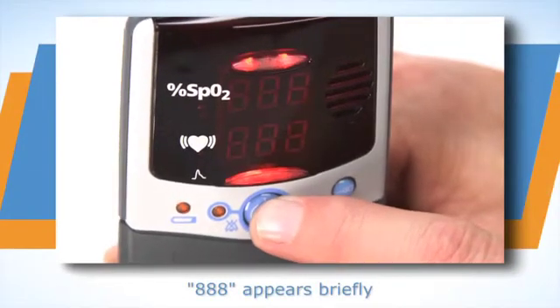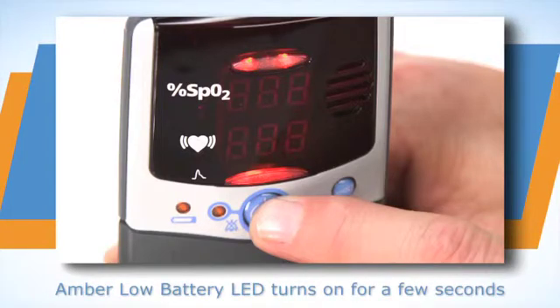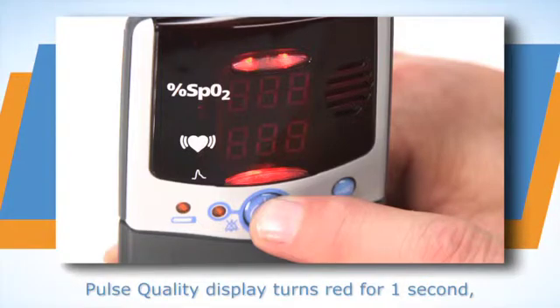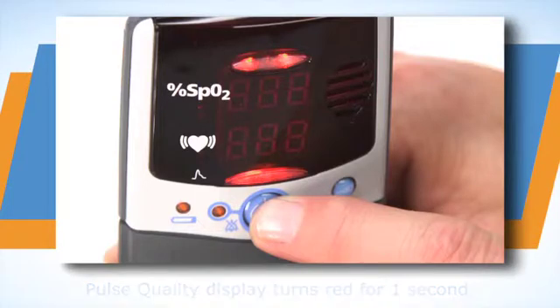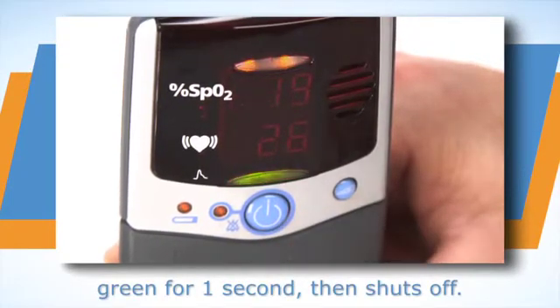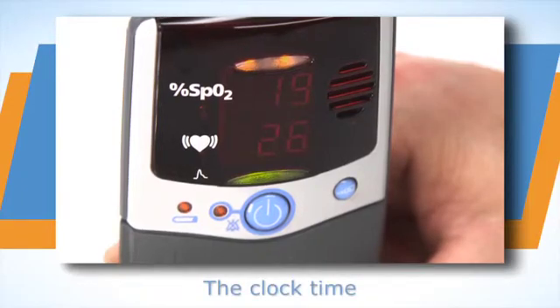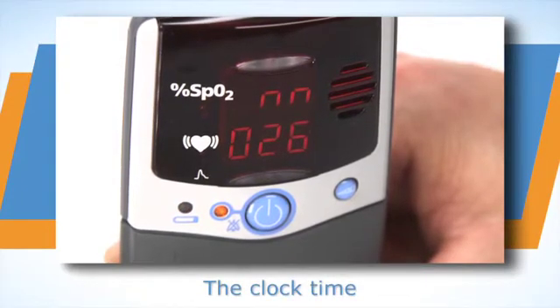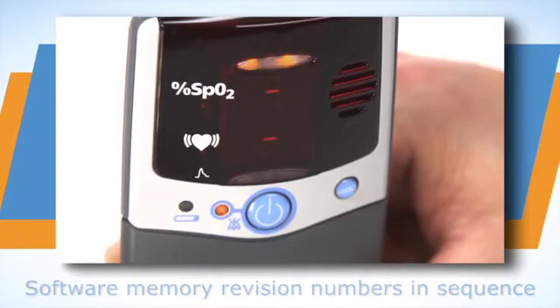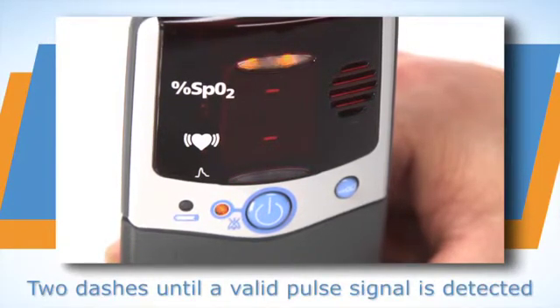Press the ON/OFF button to start the unit. The oximeter will run through a power-up systems check as it turns on. Watch the systems check to ensure all the LED elements and information appears as shown here. If any LED elements do not appear or if any of the displays do not appear as expected, remove the unit from use and return it for service or repair.